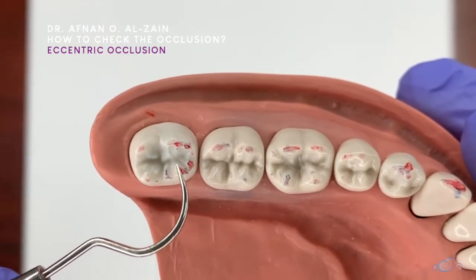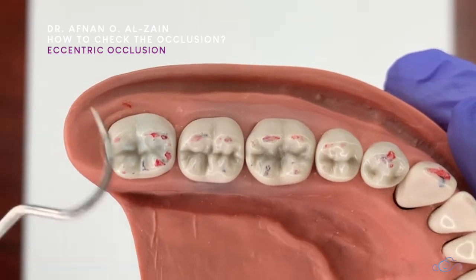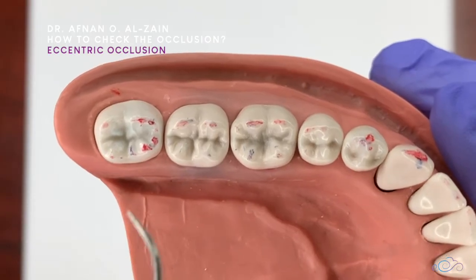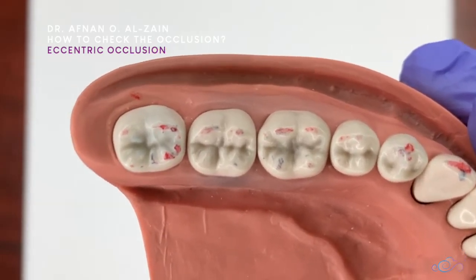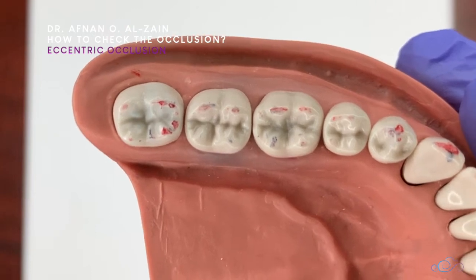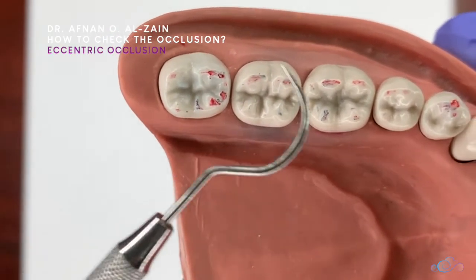For example, if you did the restoration in a tooth and it shows darker markings on the mesial side, those areas are high. You would remove those high points and then check occlusion again. It is very important to remove the high points, otherwise the patient can suffer from severe headaches, migraines, ear pain, TMJ problems, or similar issues. Always check occlusion before the patient leaves your clinic, adjust if needed, and check again.